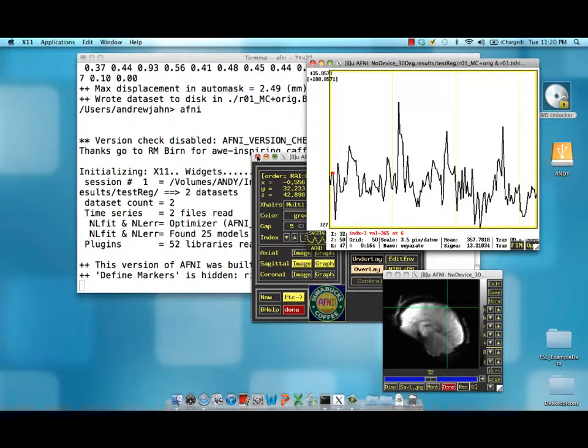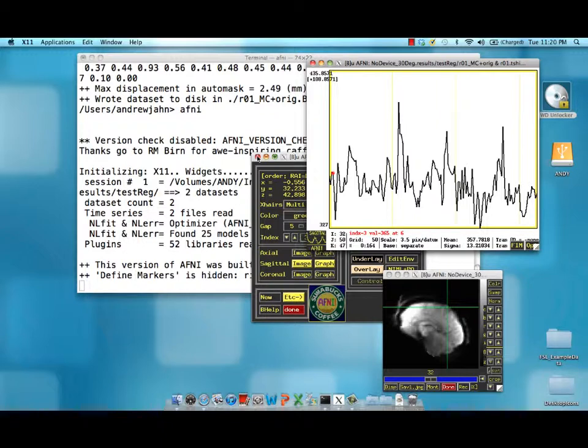It's always good to check your volume registered motion corrected data to see whether anything was thrown way off.